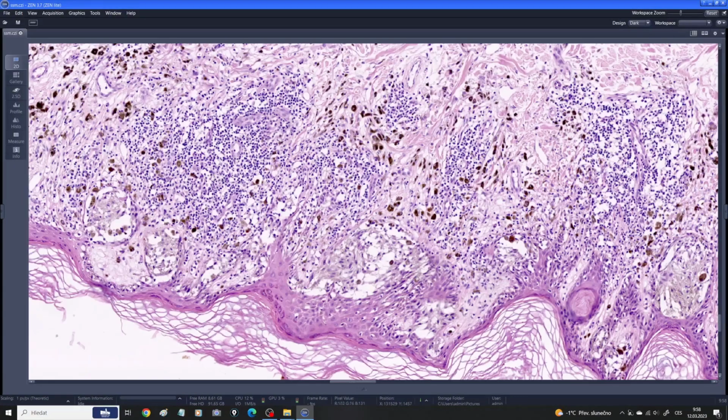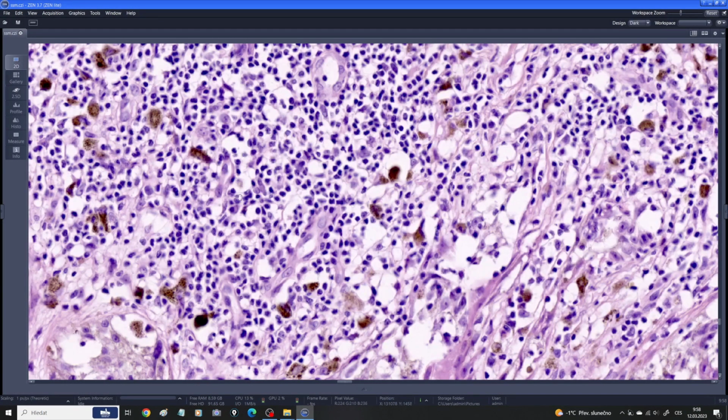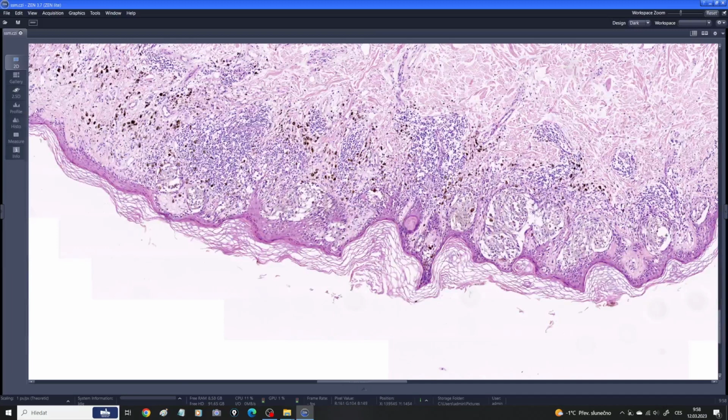What you can also see here is the inflammation. So those small black dots are not melanocytes, but lymphocytes and some plasmacytes. So there is an inflammation, and it is quite common. Melanomas are very commonly inflamed, and this inflammation can lead to the regression of the tumor, as I mentioned before. So the melanoma can regress, which is not always a good sign, because of this regression, the melanoma can be hidden to the naked eye, and the first clinical manifestation can be a metastasis. So here you can also see the inflammatory reaction that can lead to the regression of the tumor.